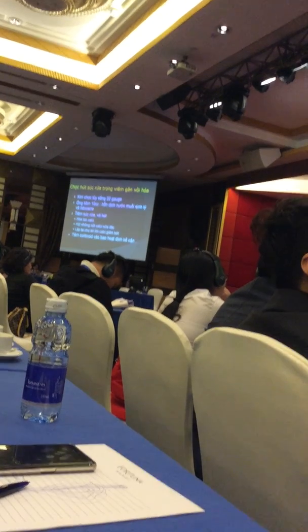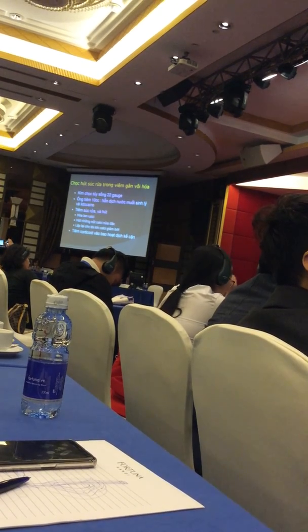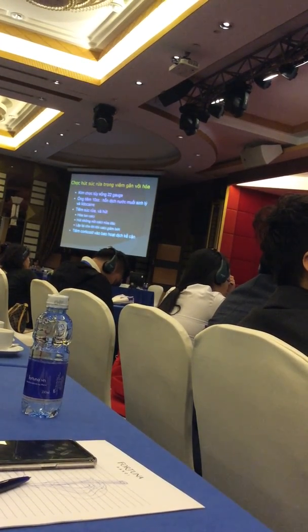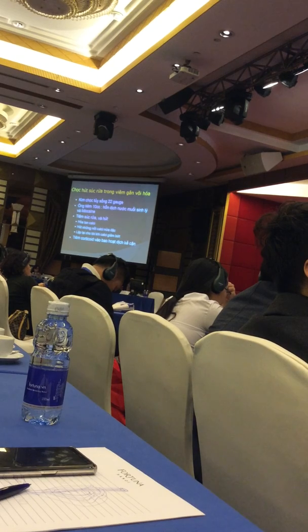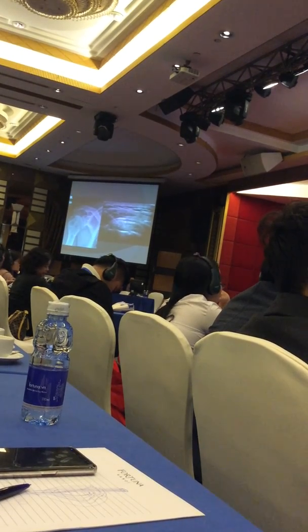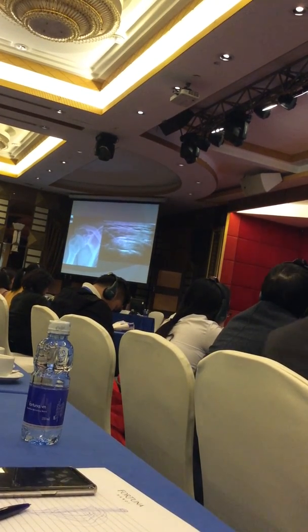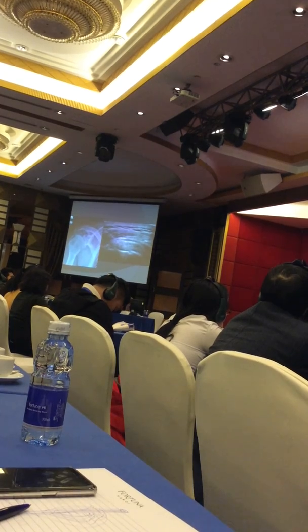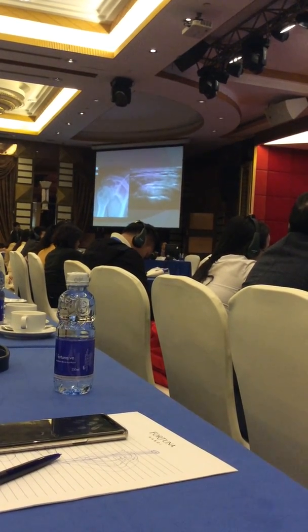I prepare 10 cc syringe mixtures, normal saline mixed with lidocaine. I inject and irrigate, then aspirate to dilute the calcification, and aspirate until the calcification decreases. Then at the end of the procedure, I inject steroids into the adjacent bursa. So this is an example. You can see on the radiograph that there's dense calcification in the supraspinatus tendon, which I try to target and aspirate as much as possible.